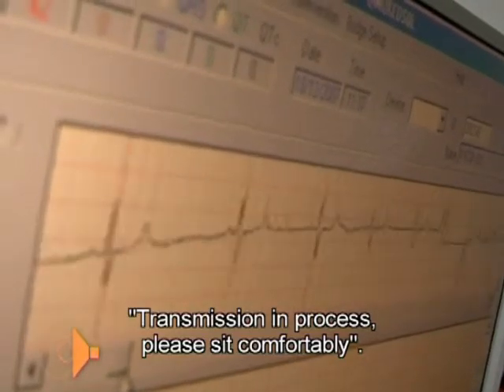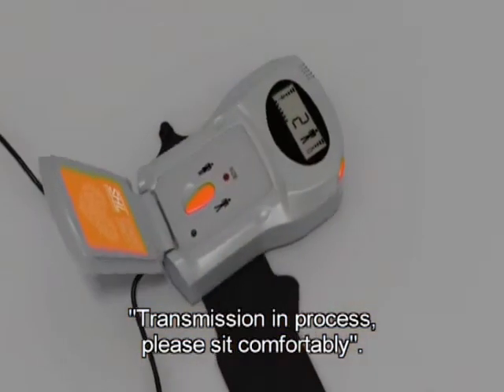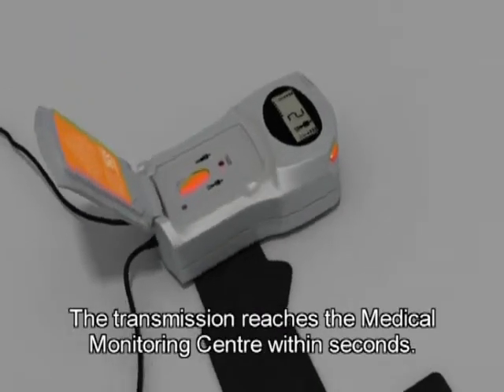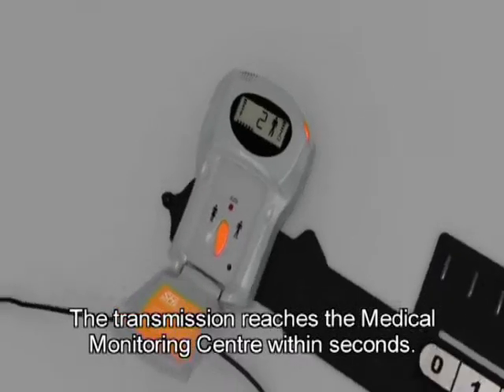Transmission in process. Please sit comfortably. The ECG is transmitted in two modes: digital and acoustic. The transmission reaches the Medical Monitoring Centre within seconds.